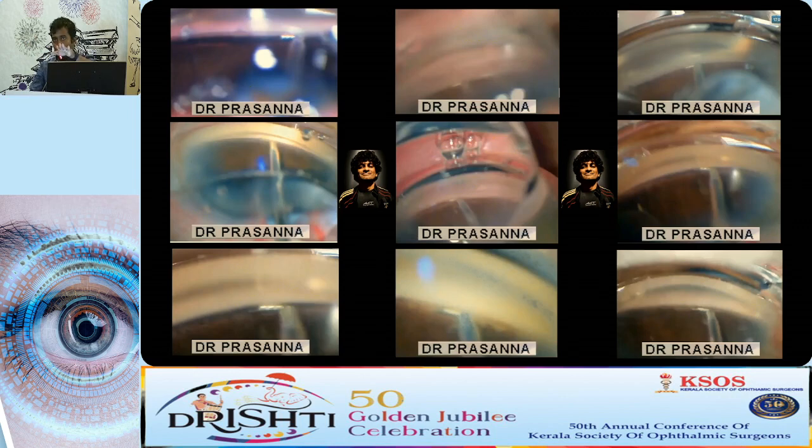So the most advanced version of this is the headset which you put on. That's a Microsoft HoloLens, so it is quite on the more expensive side. But you can also do a basic version of this using a smartphone with augmented reality. So you have a smartphone with the camera on. You use the Metaverse app. I think it's called the MCI app. Yeah, so it's the app which is there from MCI, Mahatma Center for Moving Images.